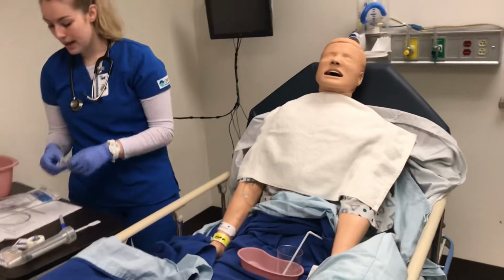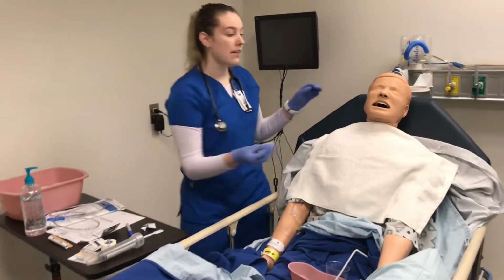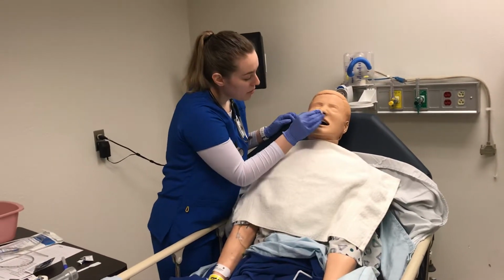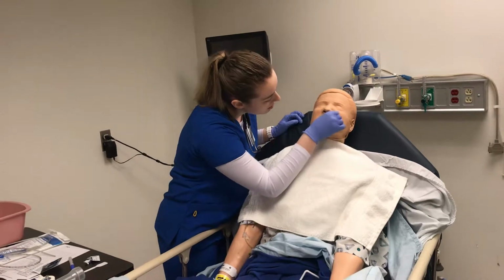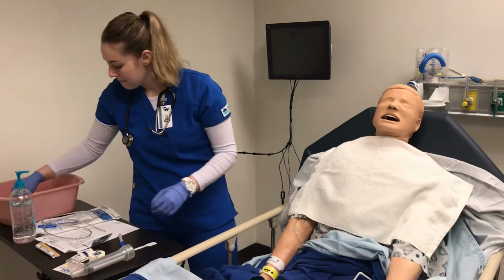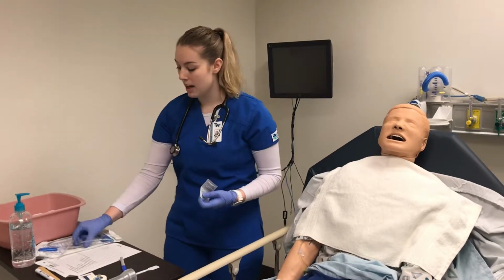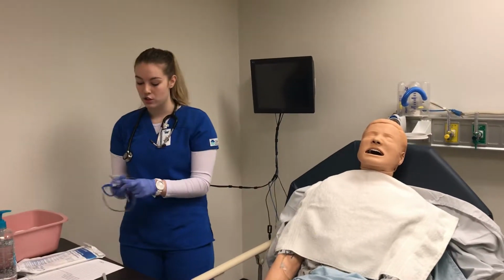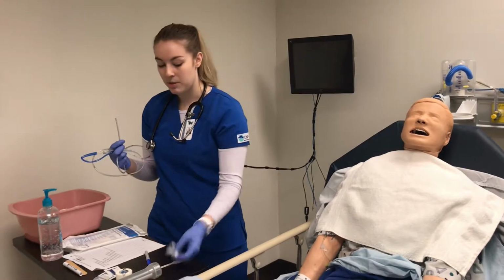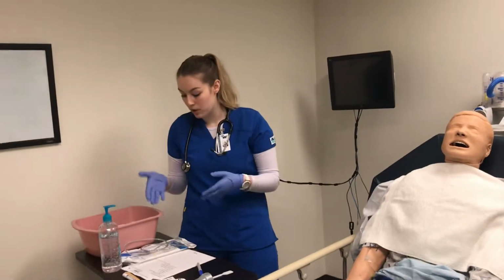So I'm going to clean Shirley's nose first. So Shirley, I just have an alcohol prep, and I'm just going to wipe your nose to get any oil or grease off, and then just wipe a little bit in the nose. Okay, and while that dries, I'm going to lube my tube. So I would dip it into my lube about 4 inches, and then it would be lubed. But because we need special lube for these mannequins, I will not actually be lubing it. But just so you know, I would lube it.